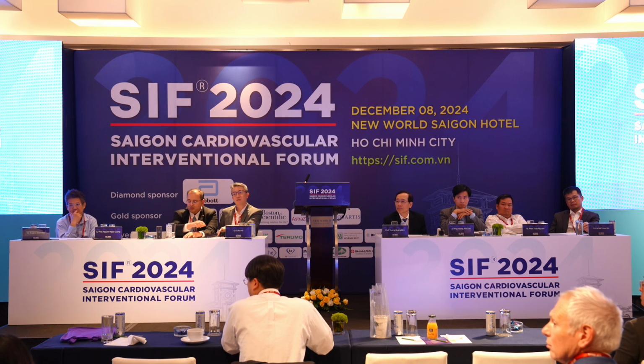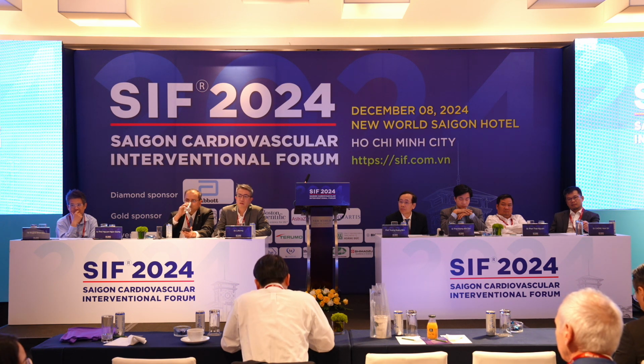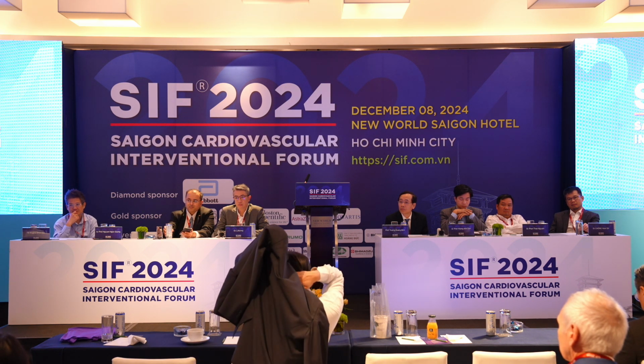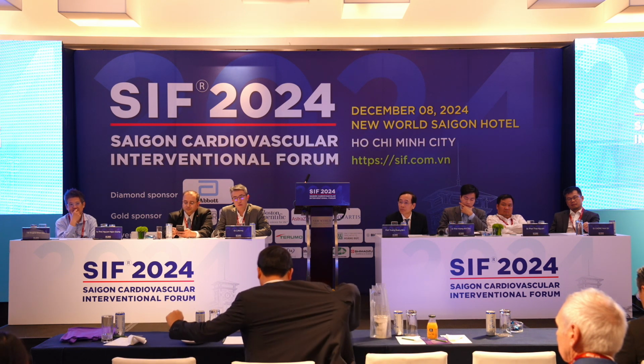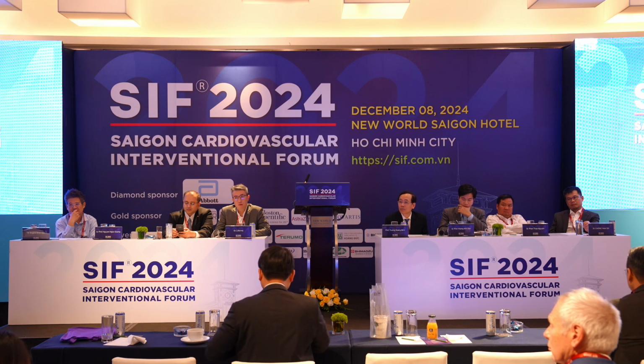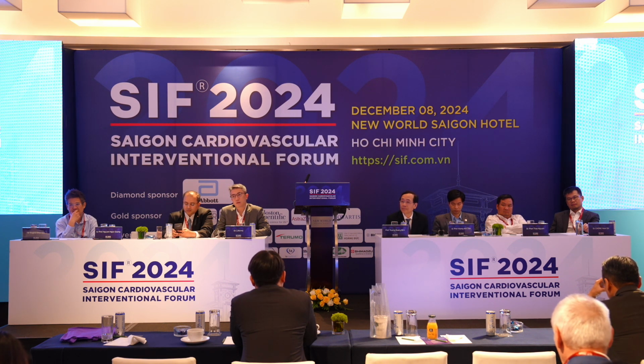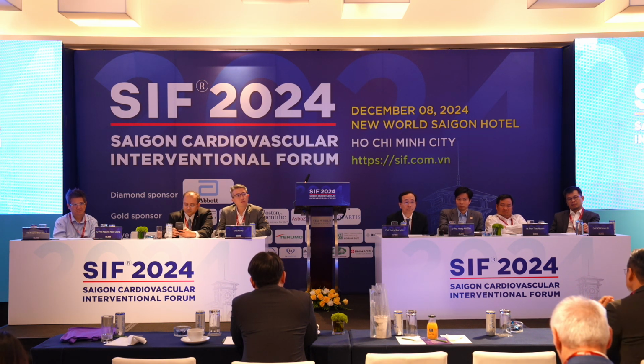I think this is a hypercoagulation state. You have to find out what is the cancer associated. It makes the patient very hypercoagulable. So you check the shadows. You cannot suck all the thrombus around the body. But on the OCT, I also think that the coronary looks quite healthy. So I think your coronary rupture came after you post-dilated with a 3.5 mm balloon for a long time. So I think that we should deploy the stent in that case quite early. Thank you.